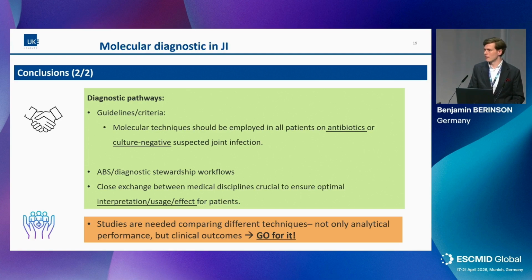And it's in my eyes very crucially important to have it implemented in antibiotic stewardship and diagnostic stewardship workflows, and also provide a close exchange between the different medical disciplines working on that patient to have the optimal interpretation, but also usage of the system, and to then ultimately have the best effect for the patient. And then I would like to end with a call for all of you listening. So far there are few studies on this clinical impact. So please go for it, gather evidence, and that would be very, very helpful to know when to use these assays and if it's actually really worth it.